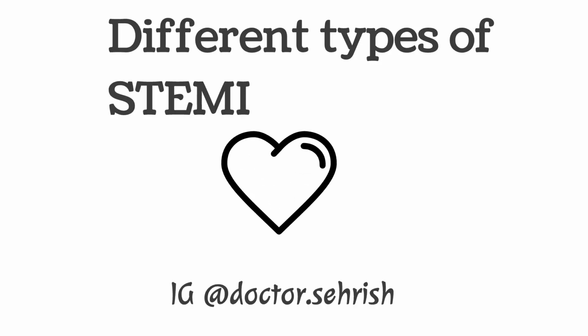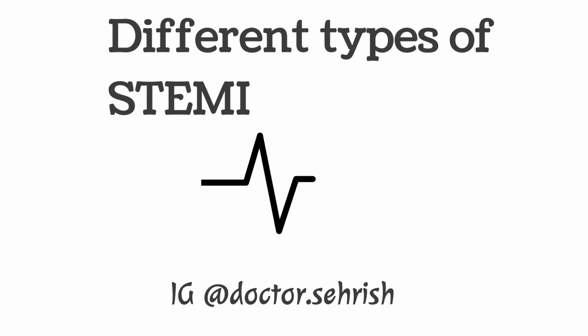Today in this video, I'm going to talk about different types of ST elevation myocardial infarctions. So let's start the video.